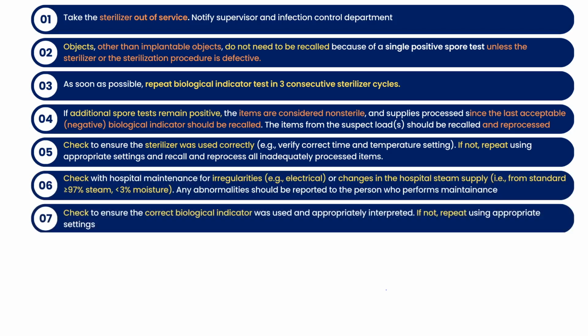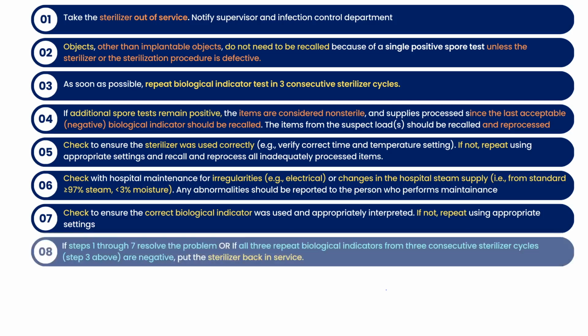Also check the biological indicator, to see whether the correct biological indicator was used or not. If not, then repeat using the appropriate one.